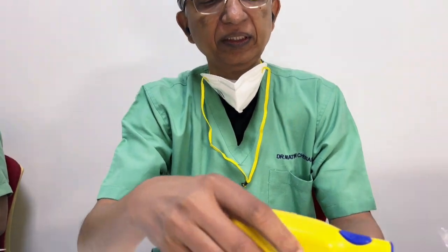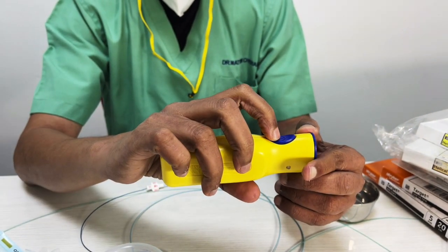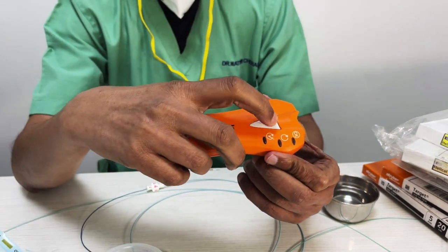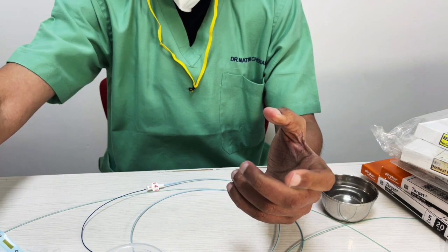So here it is. You put the coil, there will be a green light. You press it, and it will give an orange or an amber light, and you know it's detached. So all of them work on almost the same principles. A light will come up, and the third light comes on, and it is detached, right? So pretty simple.